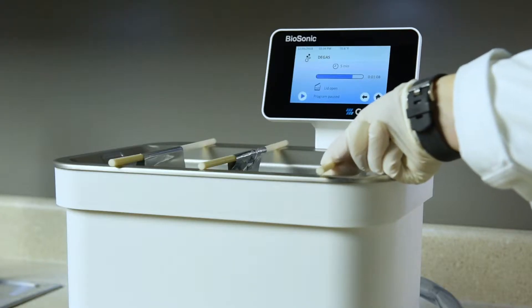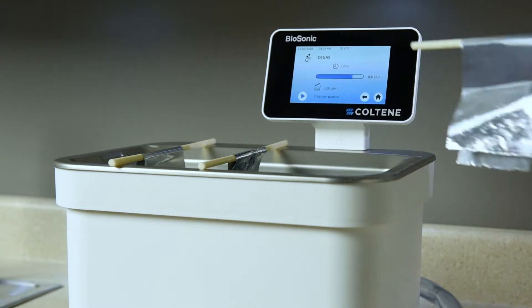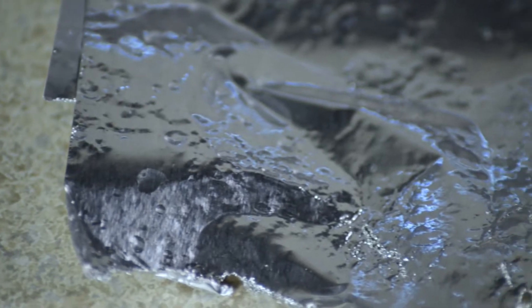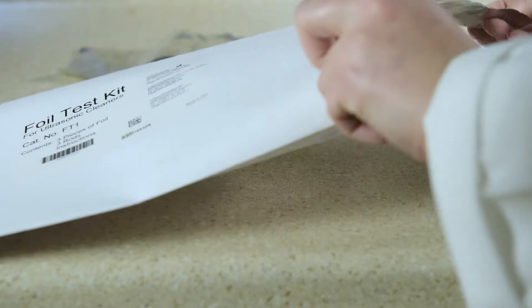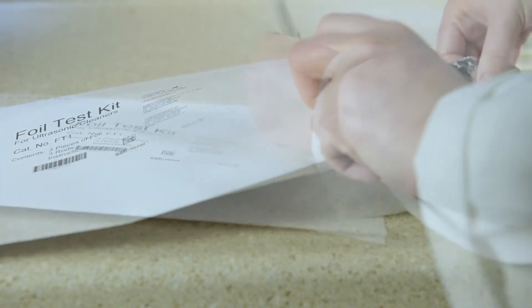Then, lift the foil out of the solution. An ultrasonic cleaner that is working properly will leave a pitted or wrinkled pattern in the foil. Holes should be observed in one or more of the aluminum foil pieces. Date the foil and keep it as a reference for the next time the test is performed.